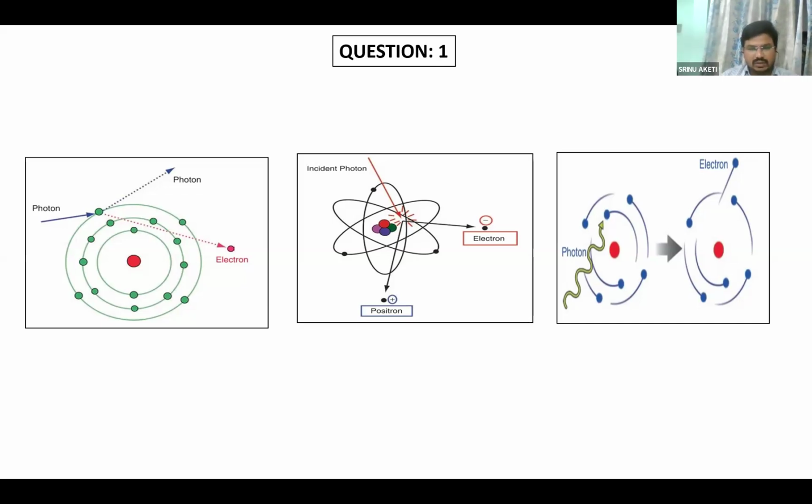Okay, no problem. So planning has to be done only on CT images because they contain electron density information. Actually, it has HU values. We will convert that HU value into electron density, with a CT to ED file, as we call it. So the TPS converts the image into electron density. Compton scatter is more predominant in the megavoltage radiotherapy beam, so we do planning on CT images only. In the case of MRI, it is proton density, not electron density. Compton scattering is proportional to electron density. So we can do planning only on CT images.